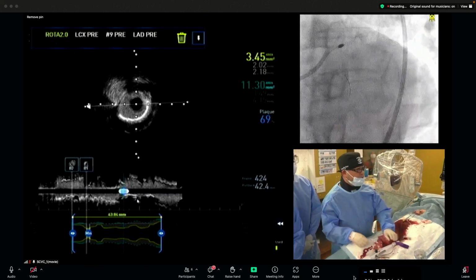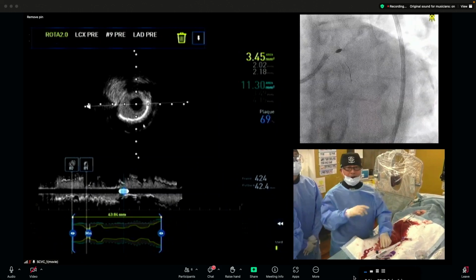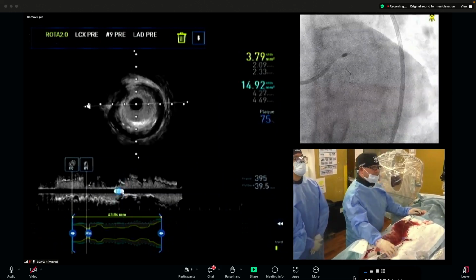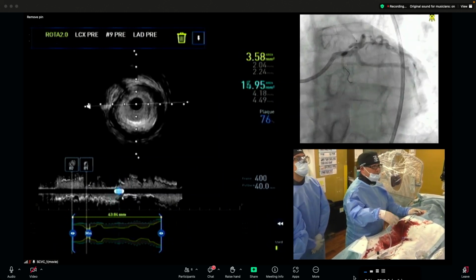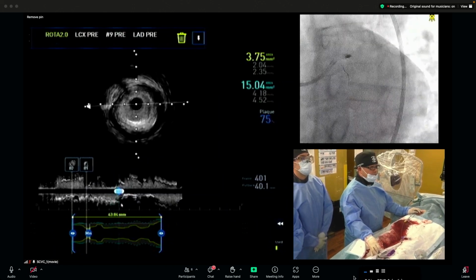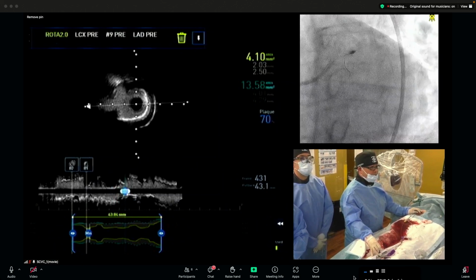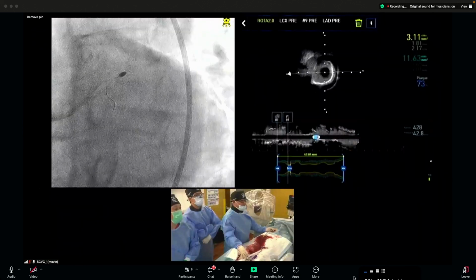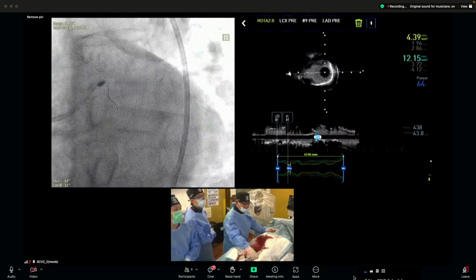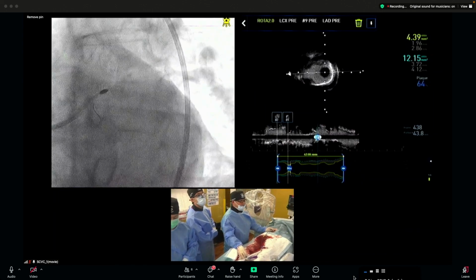Personally, I think it's not good enough, because we can see the severe calcification and the wire bias looks nice. As already mentioned, the risk of side branch occlusion in this case looks higher, because we can see the severe calcification at the opposite side of the diagonal branch, and the side branch runs parallel to the main branch. That's why Kashima sensei aggressively performed rotablator, just for the proximal part.